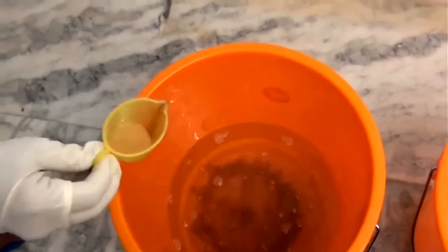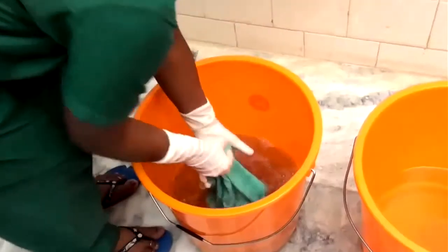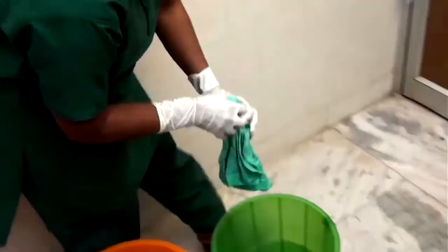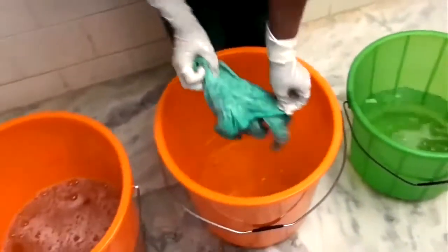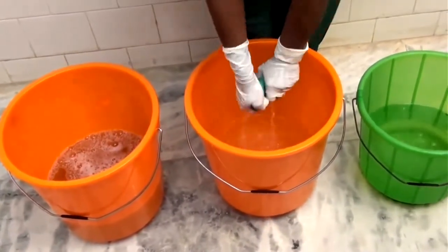And what I'm demonstrating here is the three bucket technique, which can be followed by everybody. It's a very simple method. In the first bucket, you have the proper dilution of the disinfectant. Wipe. Go to the third bucket, which is clean water. Rinse it properly. Come to the second bucket, which has a mild dilution of the disinfectant or clean water.